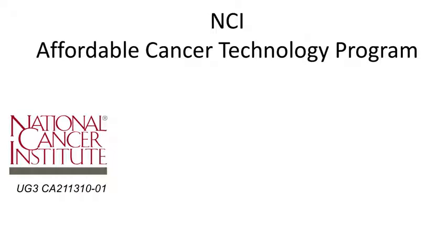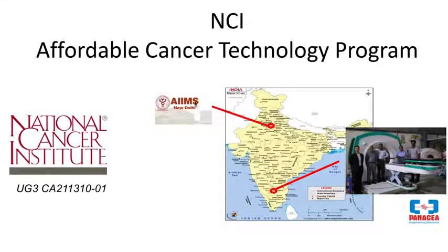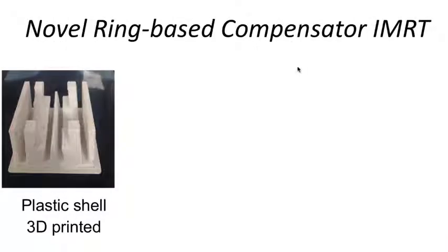This is something that's funded by the National Cancer Institute under the Affordable Cancer Technology Program. And our project is a partnership with the All India Institute of Medical Sciences in New Delhi and a commercial partner, Panacea Medical Technologies in Bangalore, India. We're designing a system that's novel. It's a ring-based compensator system to deliver intensity modulated radiation therapy.